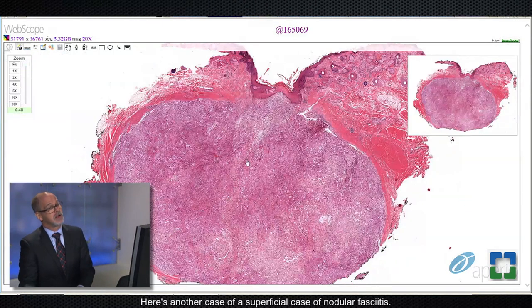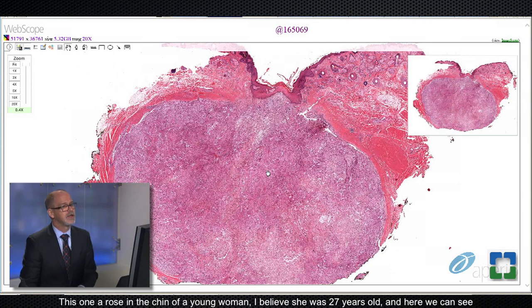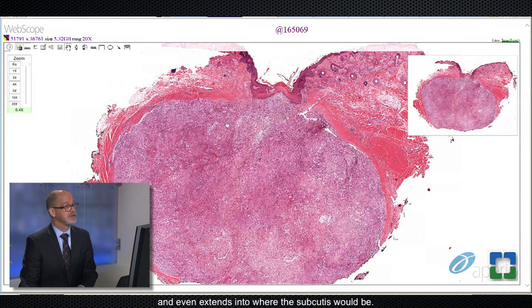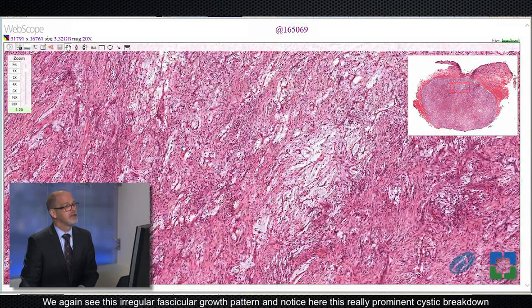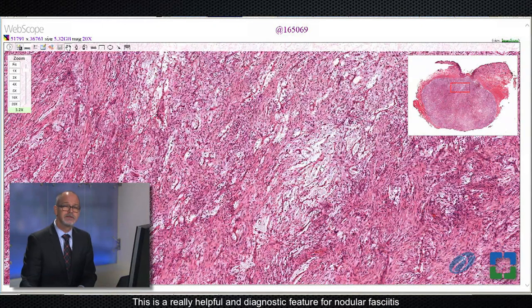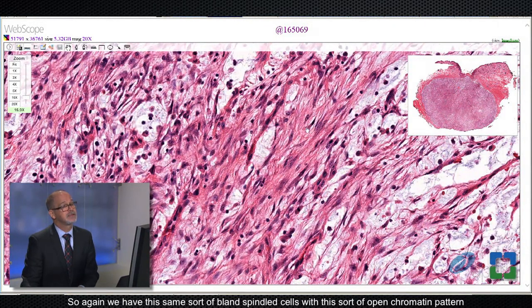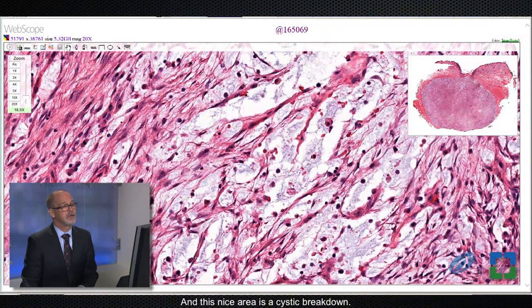Here's another case of a superficial nodular fasciitis. This one arose in the chin of a young woman, 27 years old. We can see this rather large circumscribed lesion that grows throughout the dermis and even extends into where the subcutis would be. At higher power, this one is a little more classic for nodular fasciitis. We again see this irregular fascicular growth pattern, and notice this really prominent cystic breakdown where the tumor cells sort of fall apart. This is a really helpful and diagnostic feature for nodular fasciitis. We have these same bland spindled cells with an open chromatin pattern and feathery elongated cytoplasmic processes, and these nice areas of cystic breakdown.